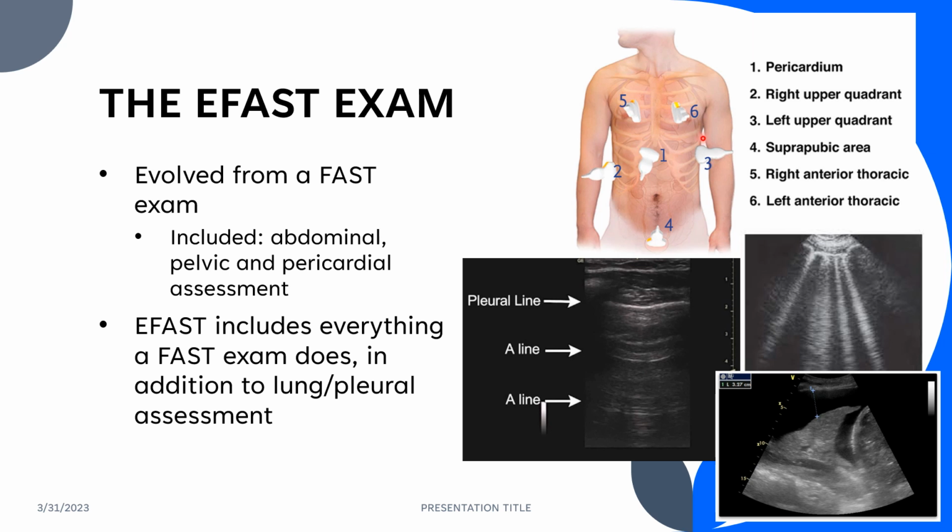Again, you'd be evaluating that lung field, looking for pleura sliding to rule out a pneumothorax, and then looking for any fluid collection that could rule out pleural effusion or hemothorax.